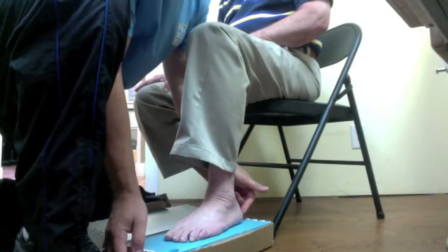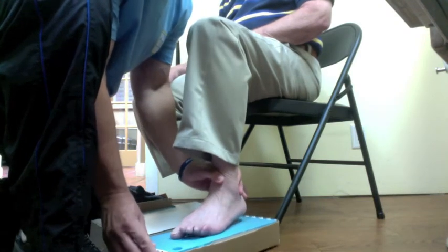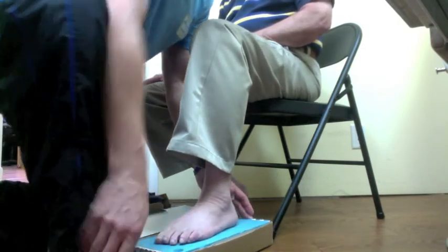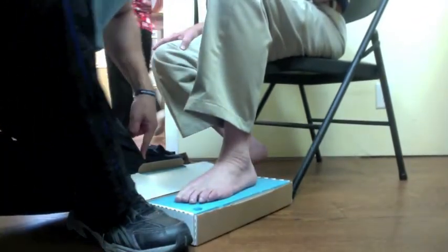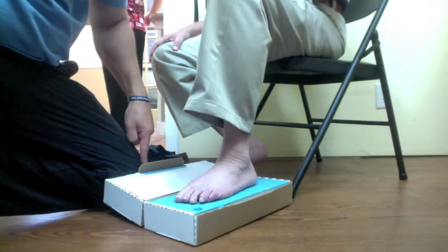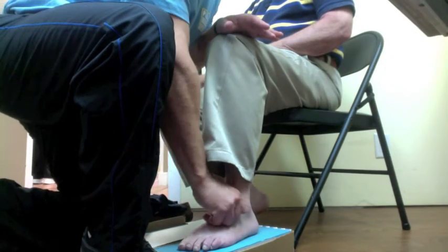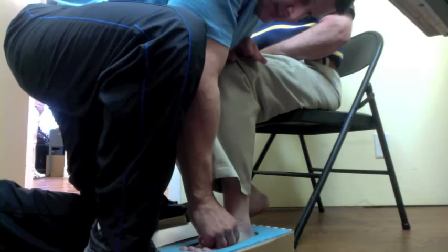You don't want the foot too close to any edges on the foam where the foam's going to snap. Try to get it as close to the middle of the foam as possible. I put my shoe up against the box here, and my knee from the opposite leg up against the box here, so it won't move when you're making the impression. So my knee is here and then my foot goes here — you don't push in, you let Sherry push it all in, in one motion.